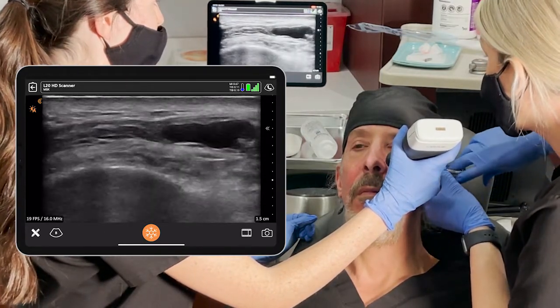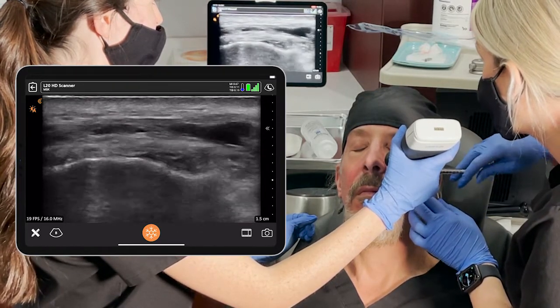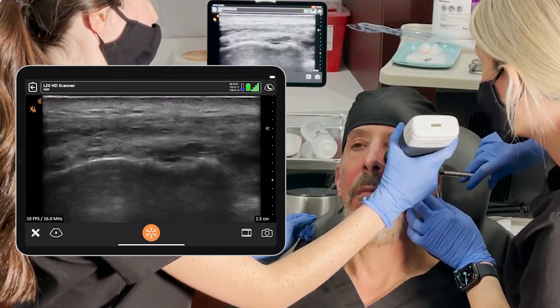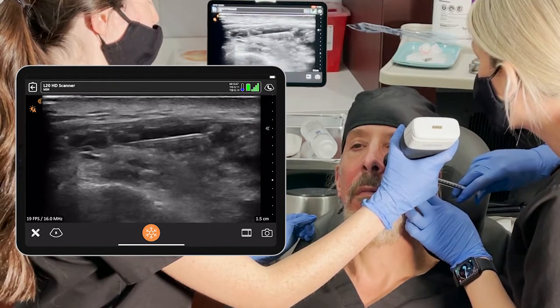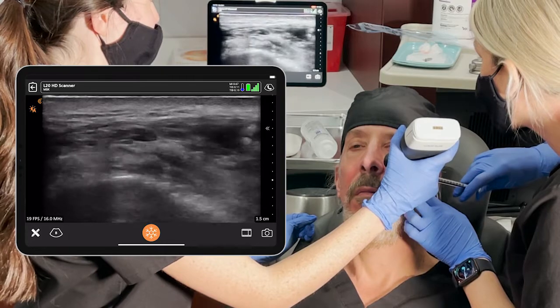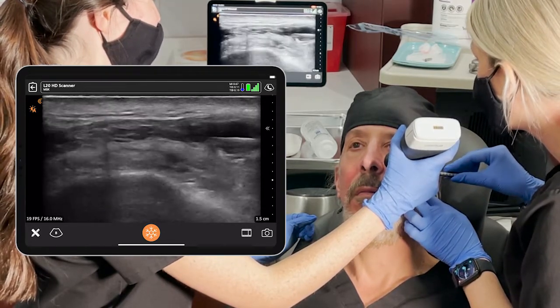There is an enhancement feature for needle visualization, which makes the needle or cannula even better visualized on ultrasound. In this case I wasn't using that, and you can still see it pretty well. Keep in mind these are a lot smaller than you're used to — this is 27 gauge, so it's pretty small, and it's definitely not used to seeing a 27-gauge needle on the ultrasound.